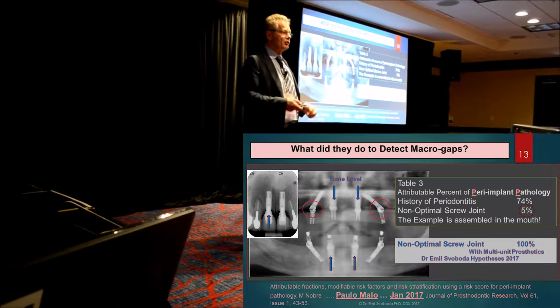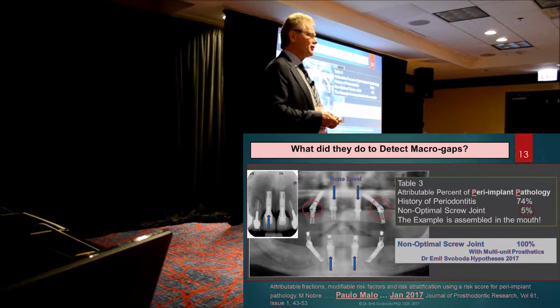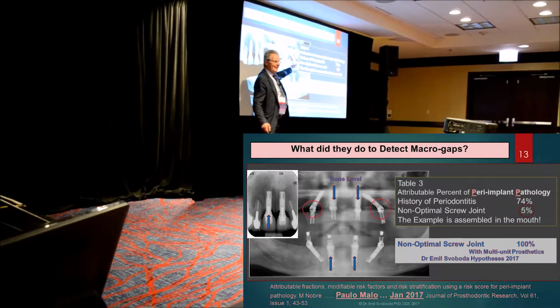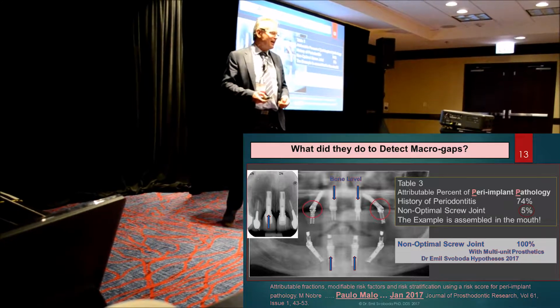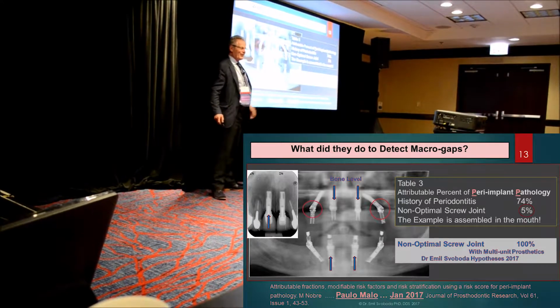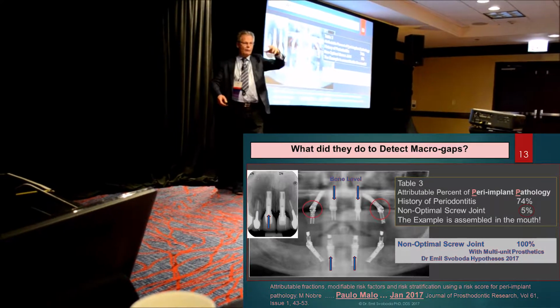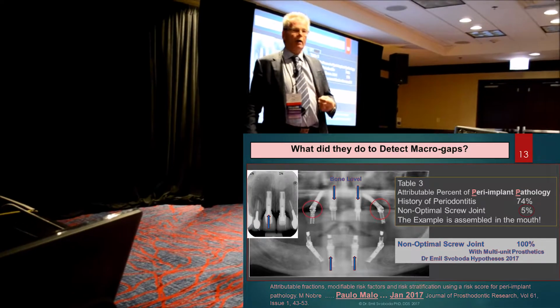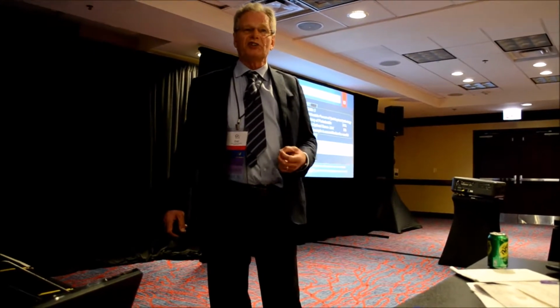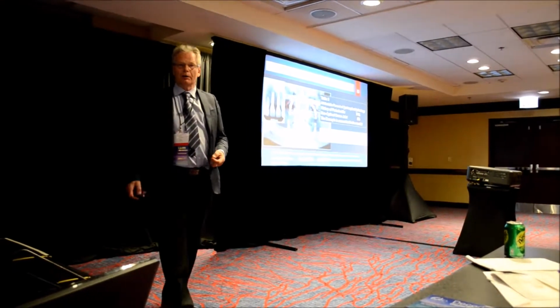I would like to suggest to you that 100% of his models, 100% of his frameworks were misfit. Because if this is what he's using to talk about a misfit in the middle, I don't think he was looking for misfits. This has got to be about 400 microns. By the time you get that big, and that's even at the other connection. What about here? A little bit of change in angle of your x-ray. You know what? Our technology in our dental offices is not competent to really evaluate for misfits unless they're really huge. Certainly not at the realm of 1 micron that bacteria are.